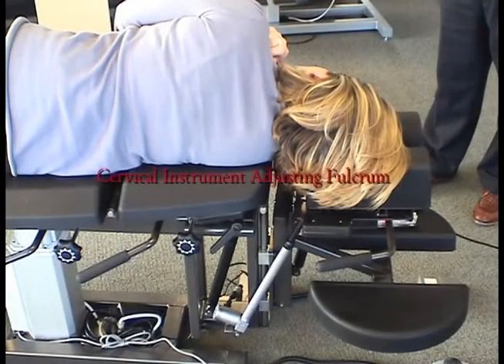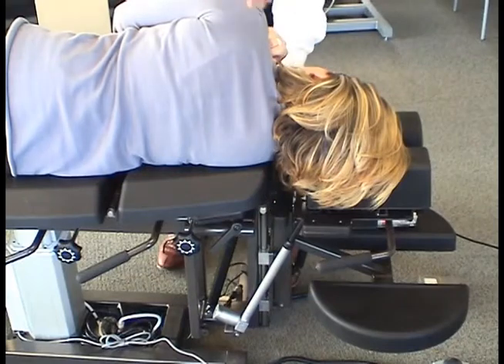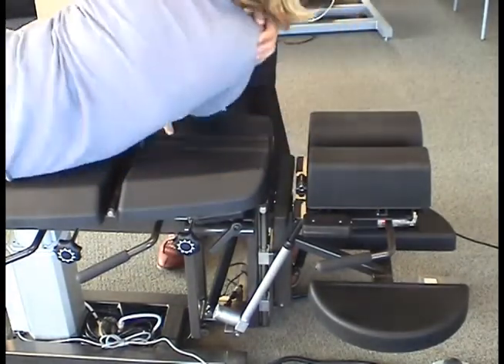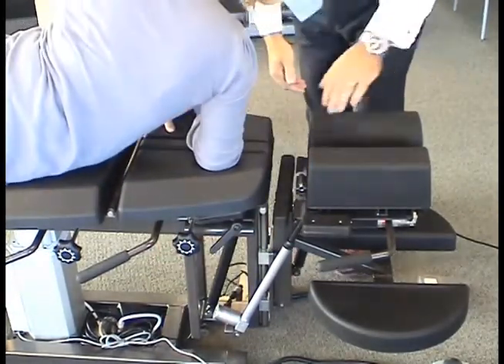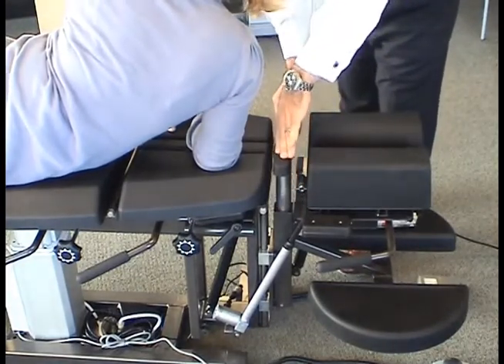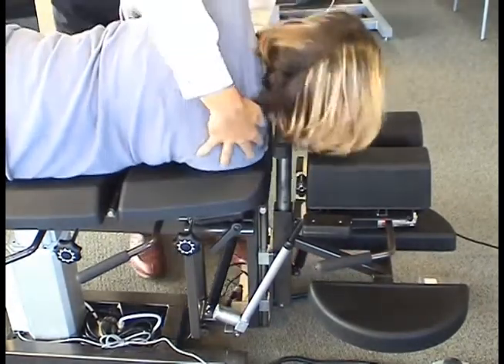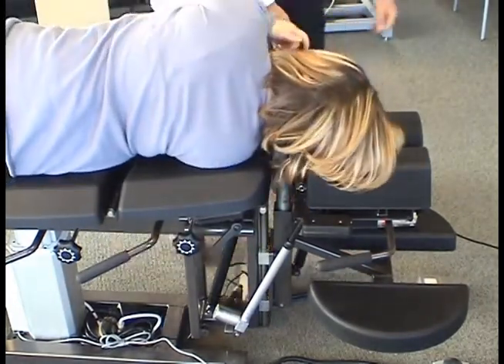Do not elevate the cervical instrument adjusting fulcrum when a patient's neck or head is immediately above it. Have the patient raise up high enough before elevating the cervical instrument adjusting fulcrum, and then position the patient on the cervical instrument adjusting fulcrum.